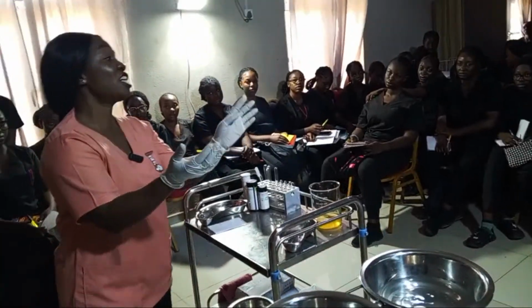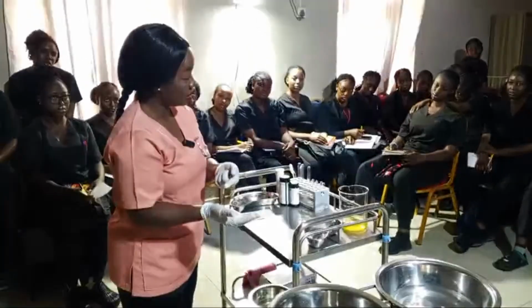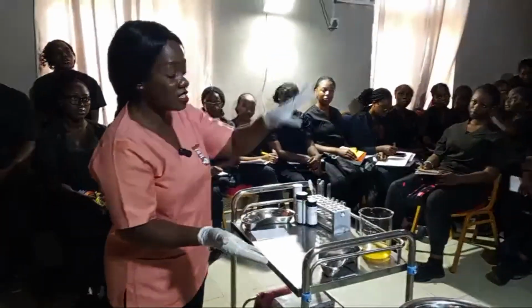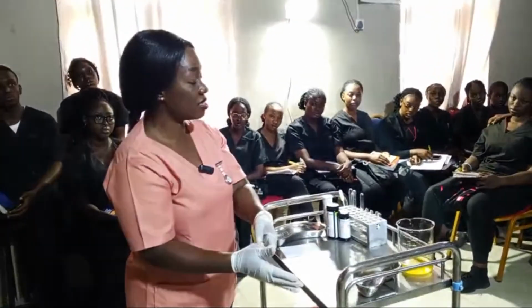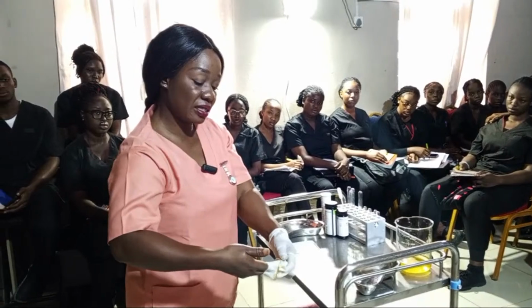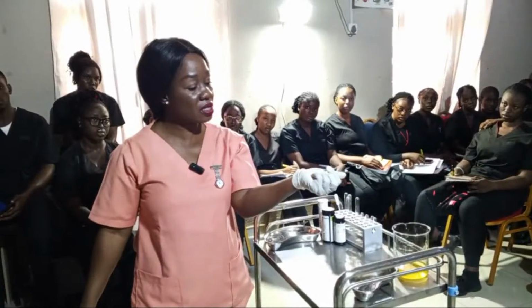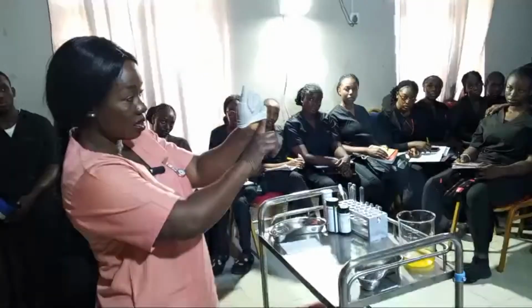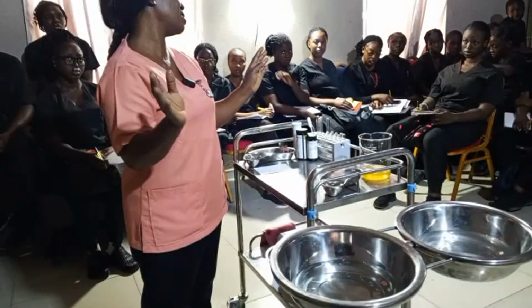When you are doffing gloves, be mindful of your body, be mindful of your hand, isn't it? Always pinch the glove this way, right? Pull it and then remove your hand. Use your non-dominant hand and close it inside. Then you use your index finger and put the index finger this way and then remove it, so you don't contaminate your body, and then discard it into the bin immediately.